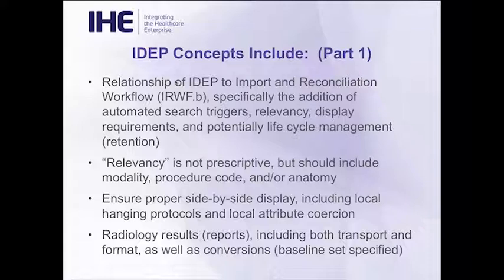However, IDEP has the addition of the automated triggers and searches, determining relevancy, which is something we'll discuss in a bit more detail, the fact that the display requirements have to be met to be side by side to really be effective, and potentially including life cycle management or retention of the studies and reports.